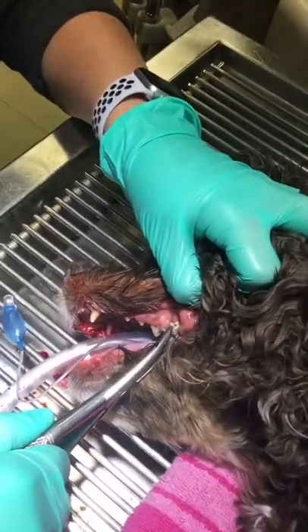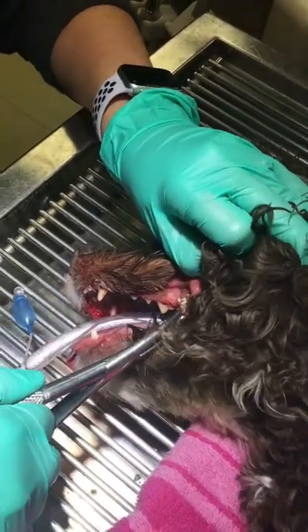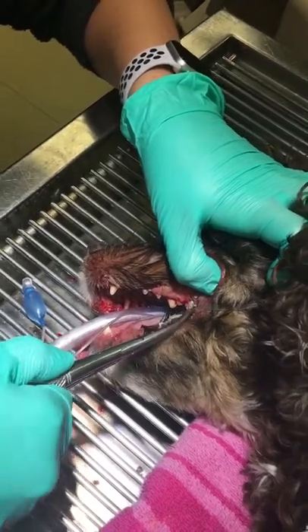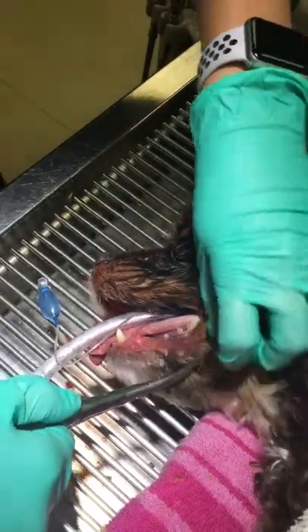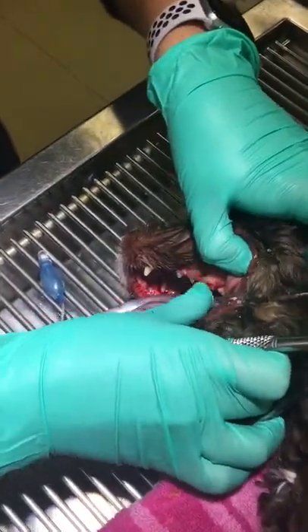Gross calculus deposits are removed using calculus forceps or dental extraction forceps. Always avoid damaging the gingiva. Basically, what I'm doing is applying slight pressure with a little bit of a turn to help break the tartar.